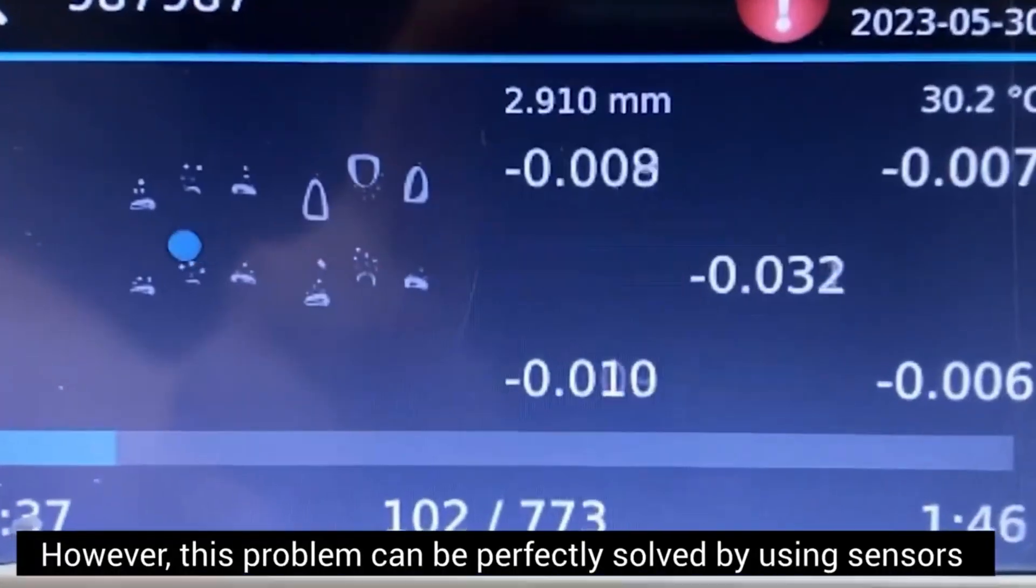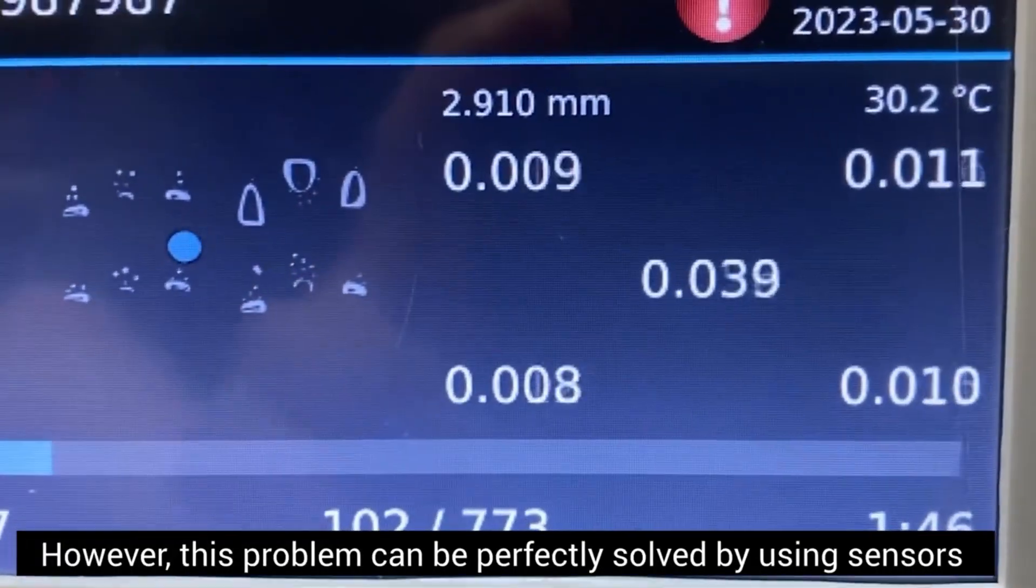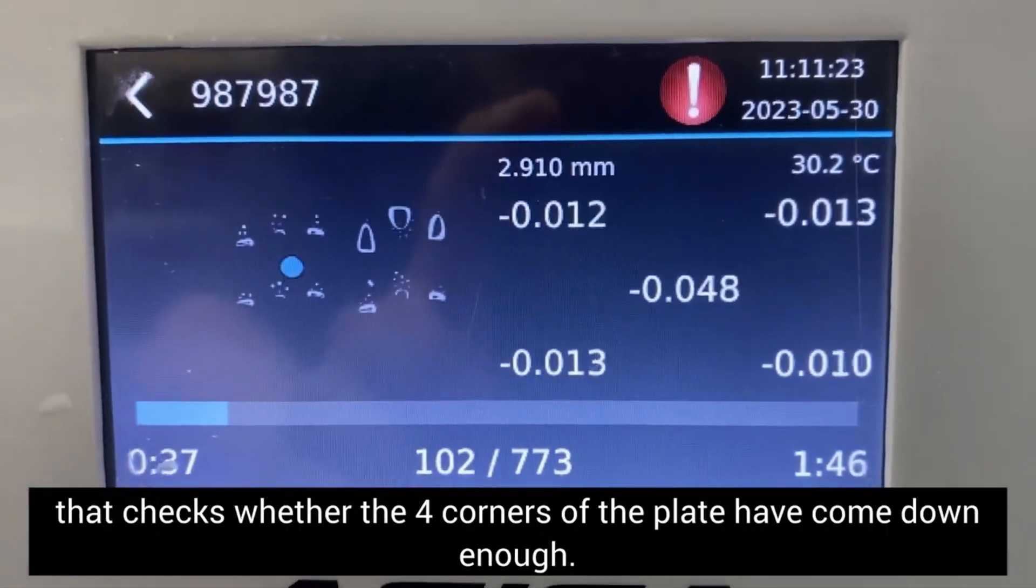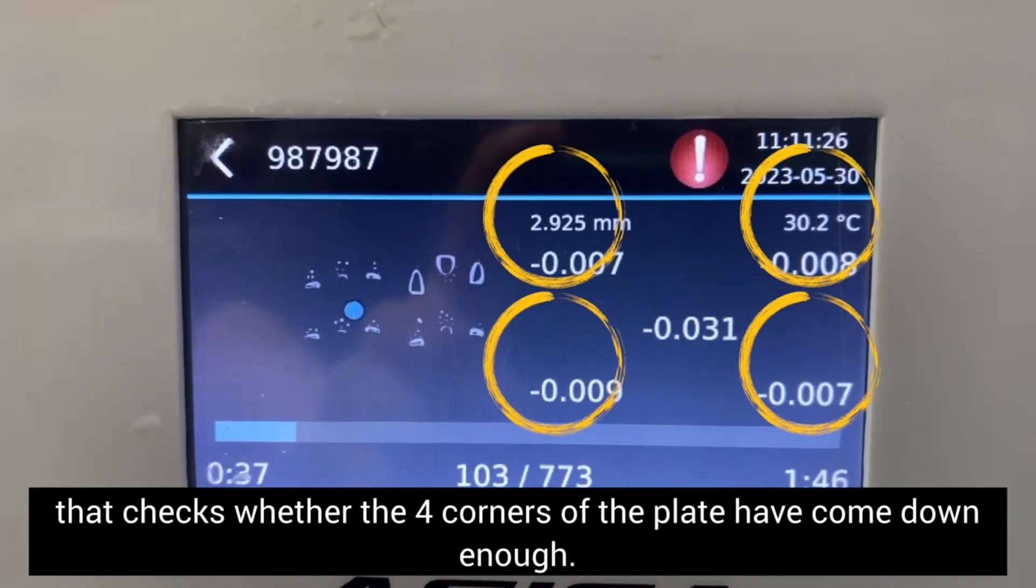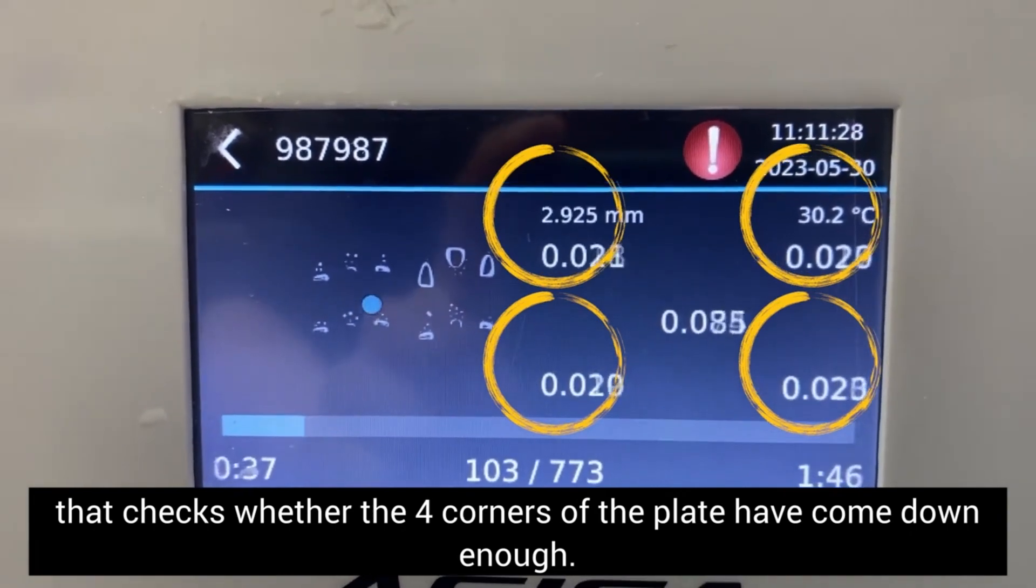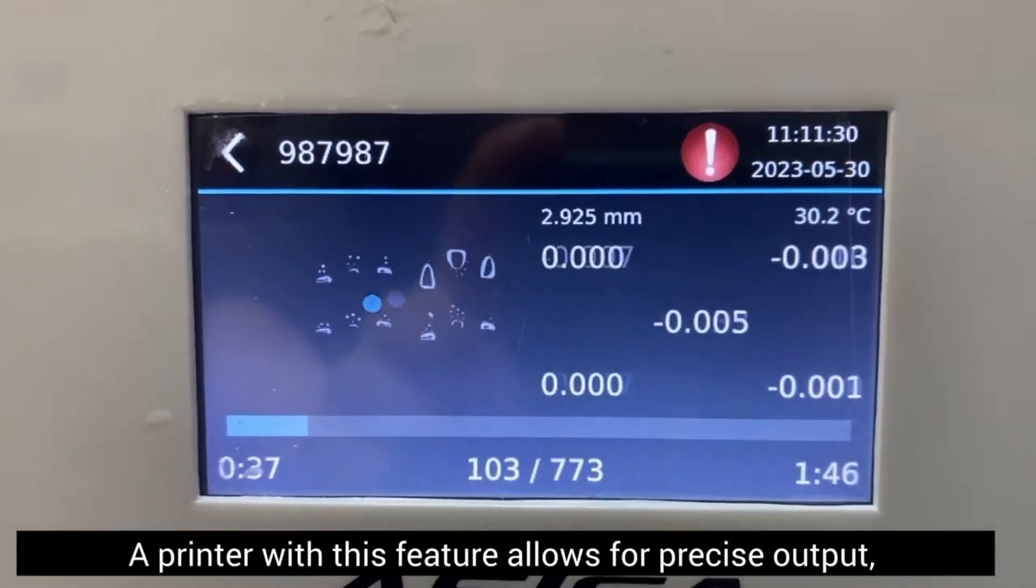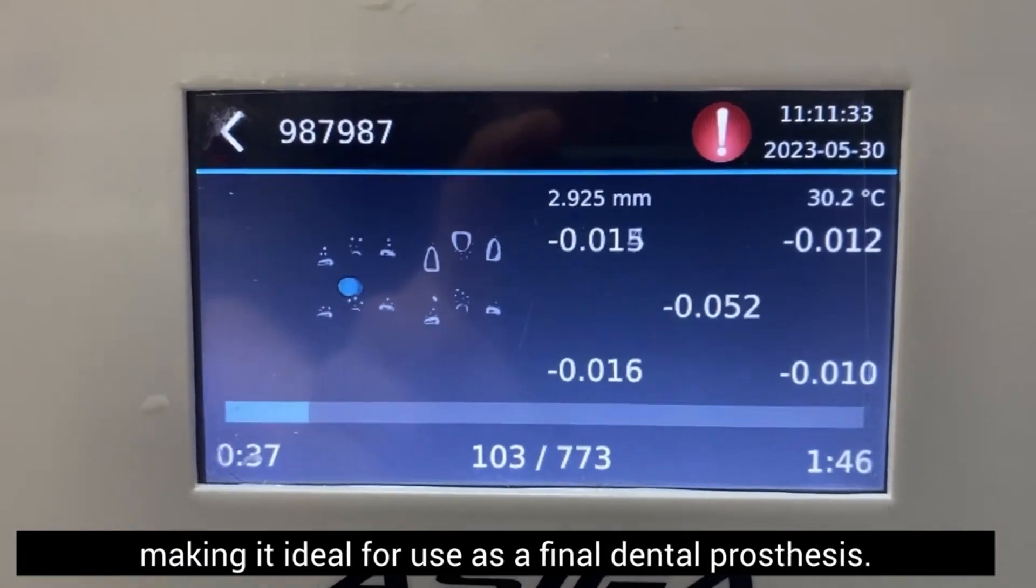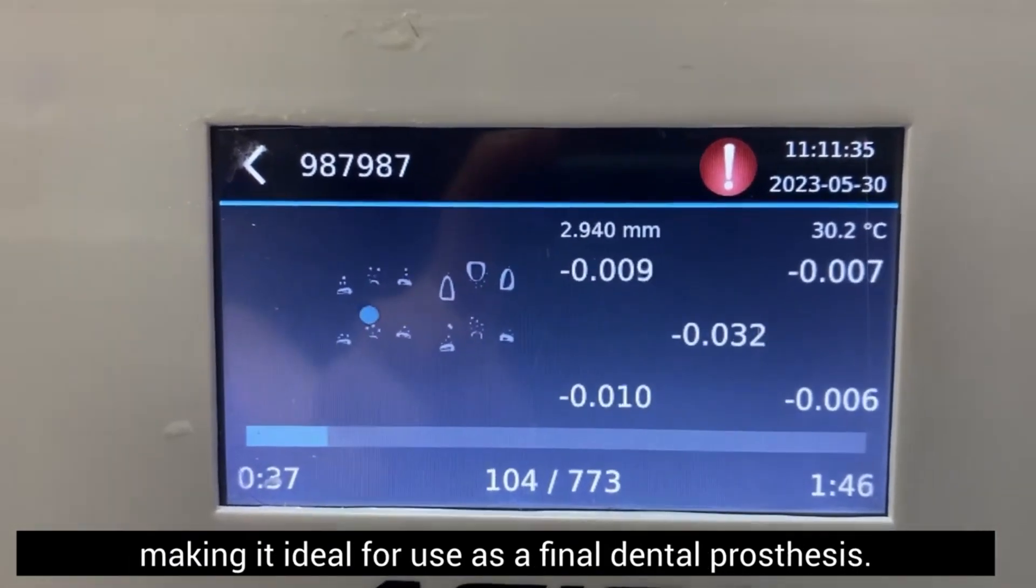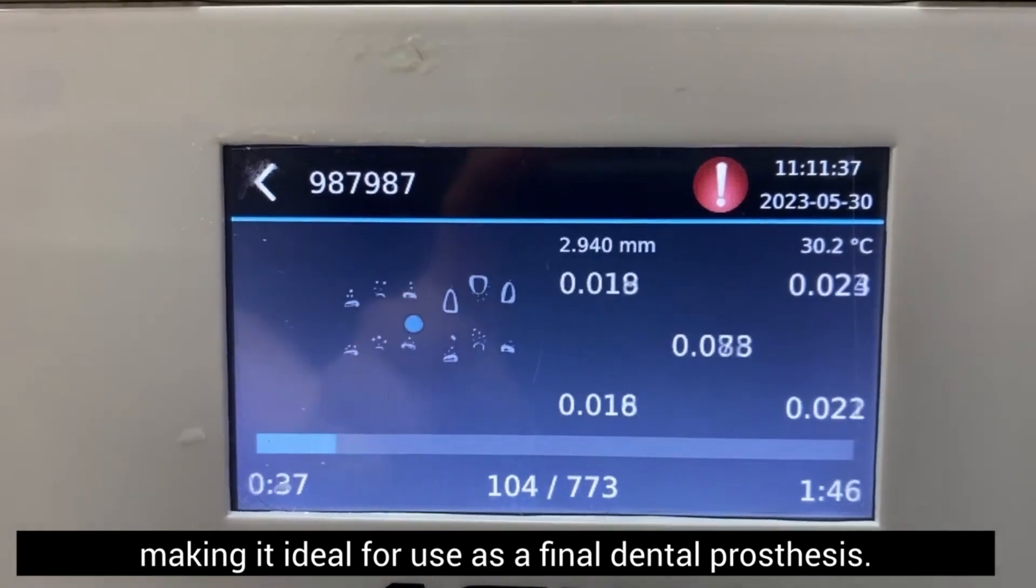However, this problem can be perfectly solved by using sensors that check whether the four corners of the plate have come down enough. A printer with this feature allows for precise output, making it ideal for use as a final dental prosthesis.